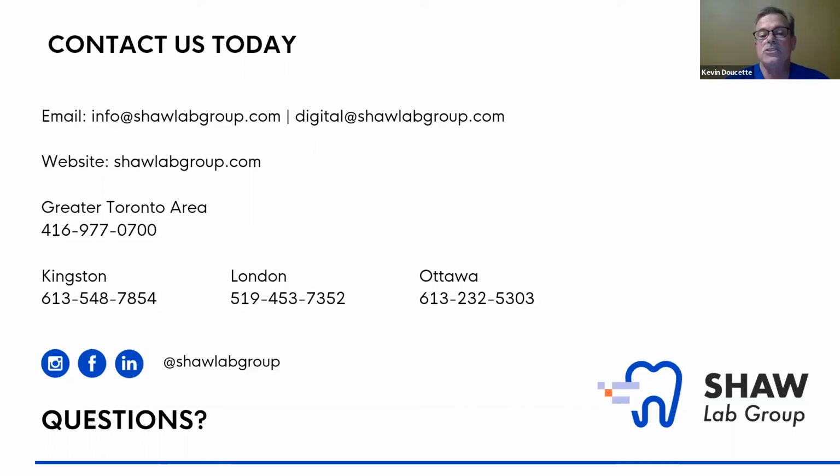Go ahead. Yeah, Amanda really hit the nail on the head there. The same issues that will give you a problem in an analog impression will give you a problem in a scanned impression. Pacing is important. Going too quickly, even though the manufacturer tells you you can do a full arch scan in 30 seconds, the computer stitches the image together, right? As you pass back and forth over the ridge, it stitches all of that information from what it's passed over. The faster that you go, the less accurate the stitching is.